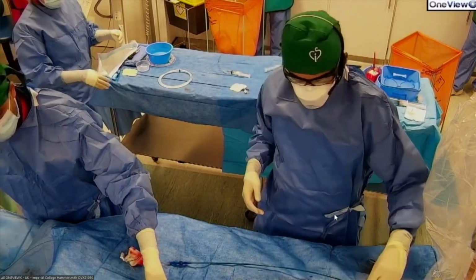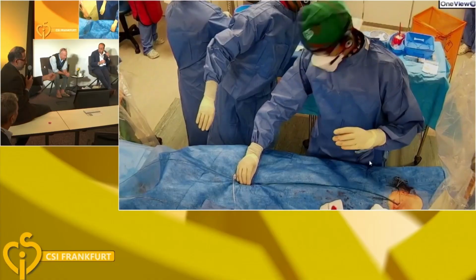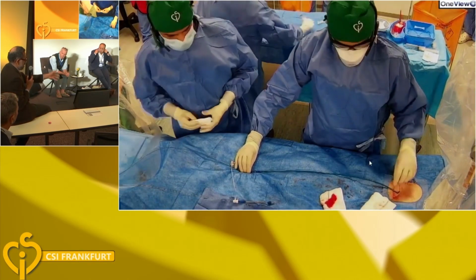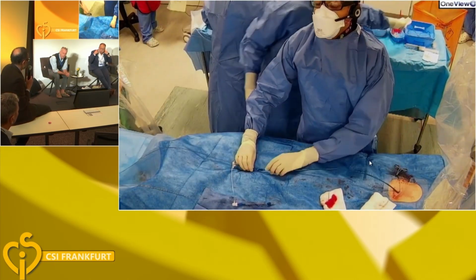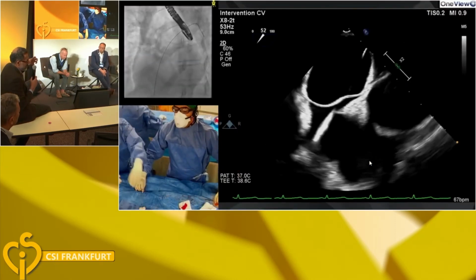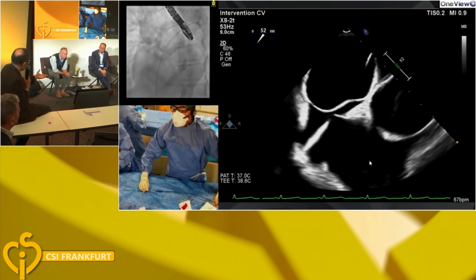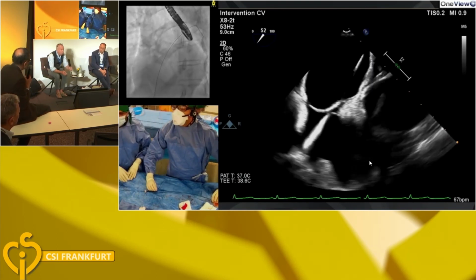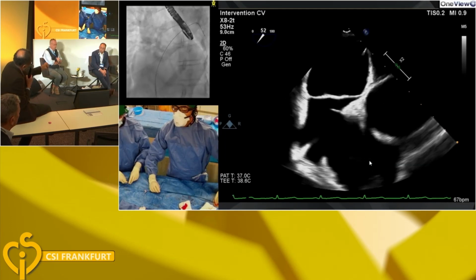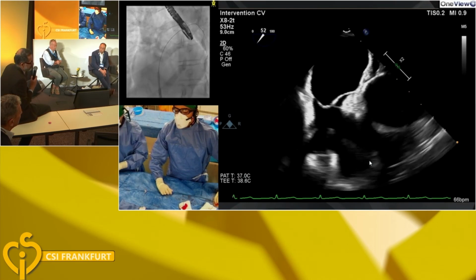Yeah. So what we did was, when pulling it in without doing that, I always pull it out again and make sure that the shape is quite right. I've got used to it from the very early days when we were using these devices. If you didn't stretch it and pull it in, every now and again the device would be in a funny shape, even a PFO device. So it's become routine to pull it in, put it out, make sure it looks all right, pull it back in the same way, and then deploy it. Maybe it's overkill, I don't know.